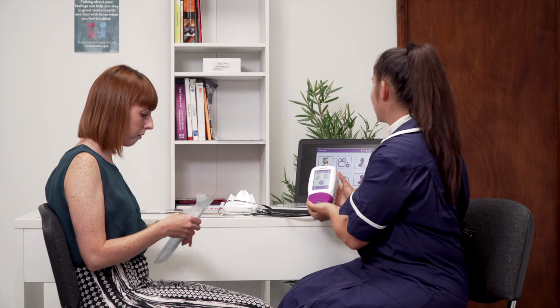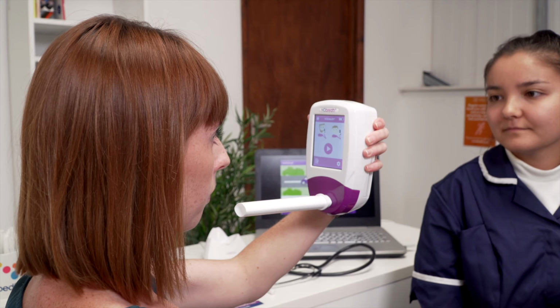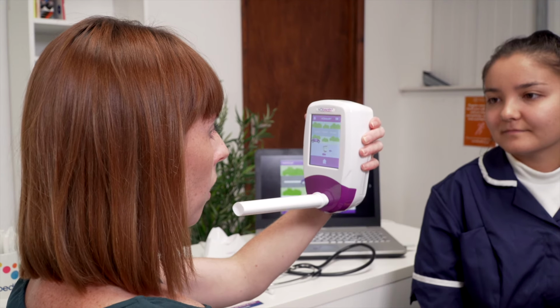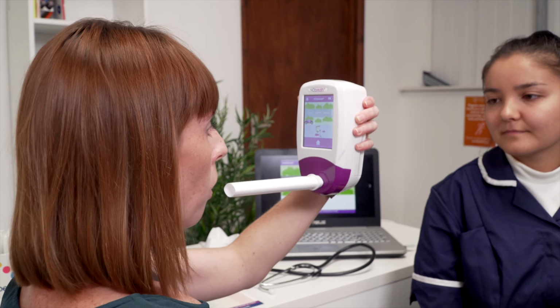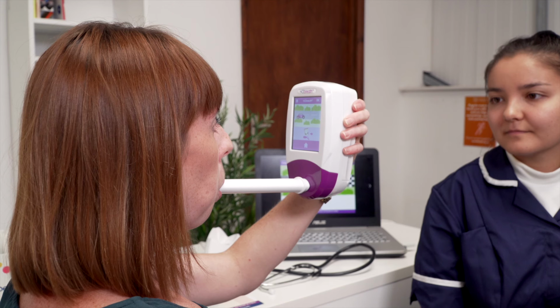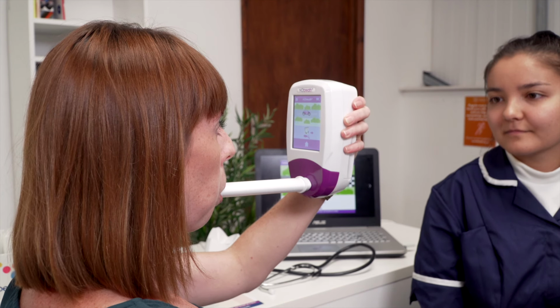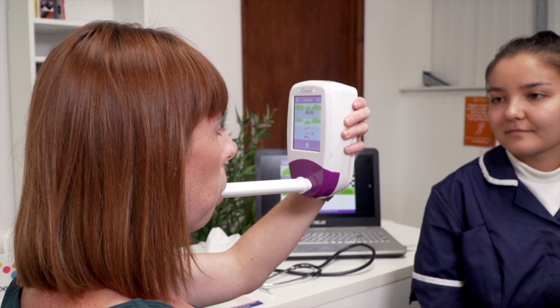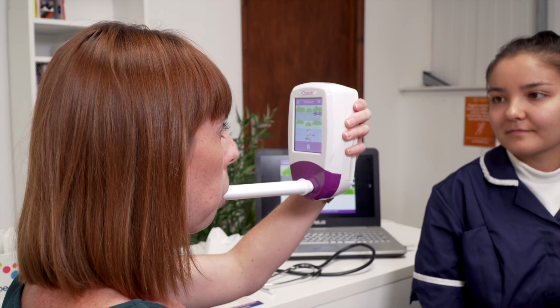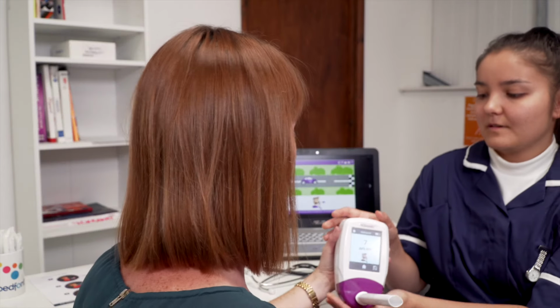To take a breath test, click on either the adult or child icon and attach a new mouthpiece to the unit. If needed, the test can be cancelled at any point by clicking the home icon. Take a deep breath, and when the exhale icon appears, keep the monitor upright and blow gently into the mouthpiece, making sure you do not cover the vent holes. The on-screen flow meter will guide you on the exhalation rate. Continue blowing until the green tick appears on screen to signify a successful test.